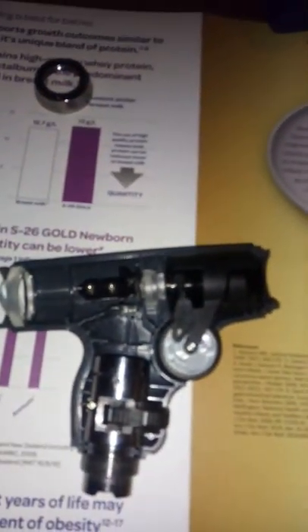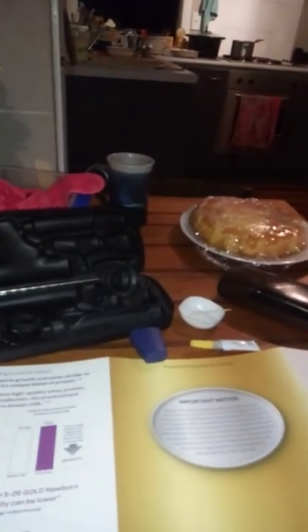So now this is all sitting back in position. The top side goes back on, and we'll reassemble it. I'm sure you've figured out how to disassemble it by this point, so there shouldn't be anything new for you there. Once the bottom ring is on tightly, you can now use it like normal. I doubt you'll be able to see through there, no. But it's all working completely fine now. So I wish you the best of luck, and all the best. Cheers.